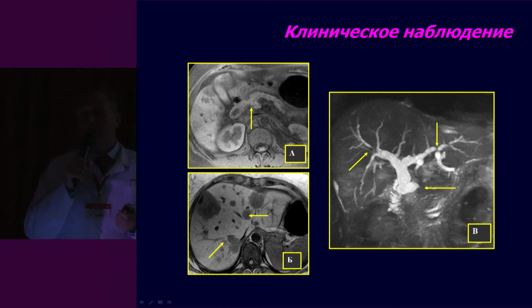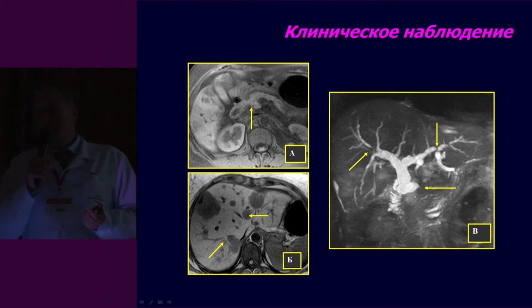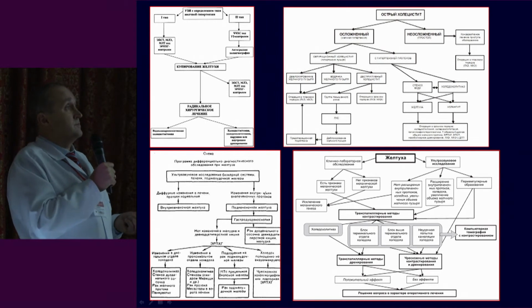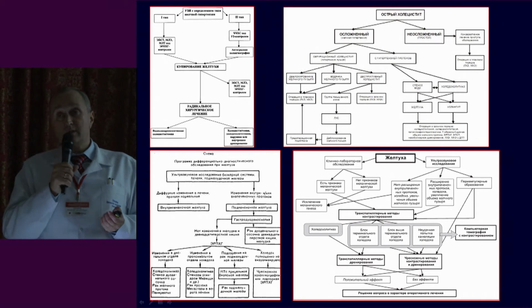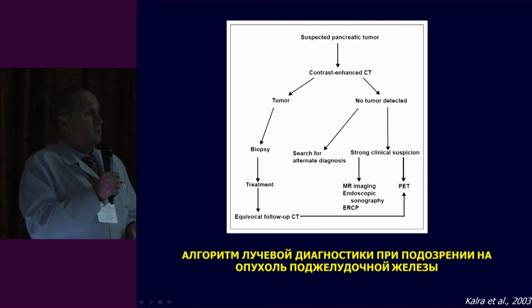has doubts about it, then you need to summon a patient in 2-3 months for a control MRI. You can see here already stage 4 with multiple metastases, and quite naturally jaundice, depending on the hospital, can be diagnosed, and the tumors can be diagnosed in different ways.